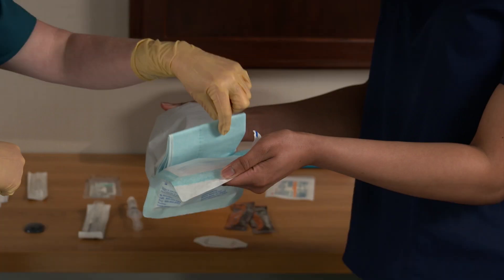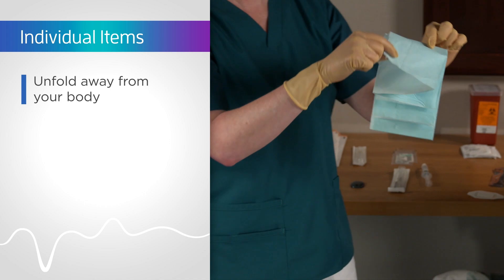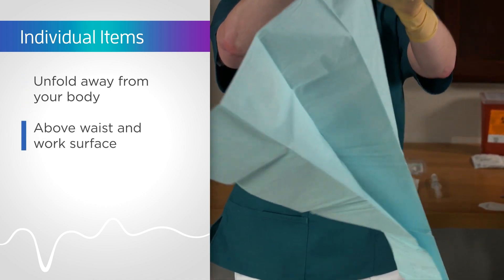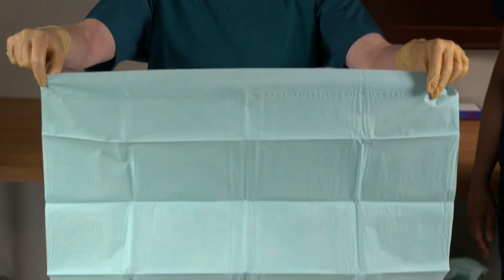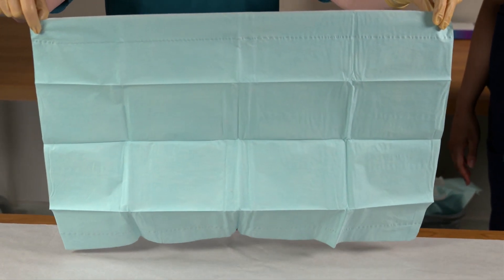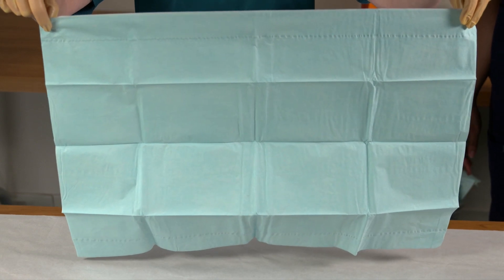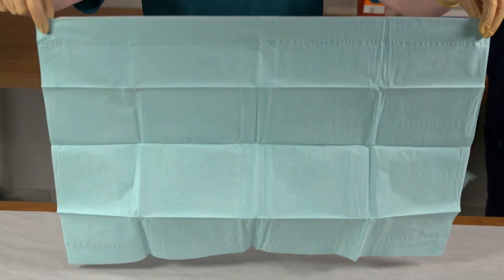Begin with the sterile drape. Have your assistant open the package and present it to you. Gently lift the drape from the opened wrapper by grasping it by the folded top edge with one hand. Let the drape unfold, holding it away from your body and keeping it above your waist and the work surface. Grasp the adjacent corner of the drape and hold it straight over your intended work surface. Ensure all edges are where you want them before placing it on the work surface.